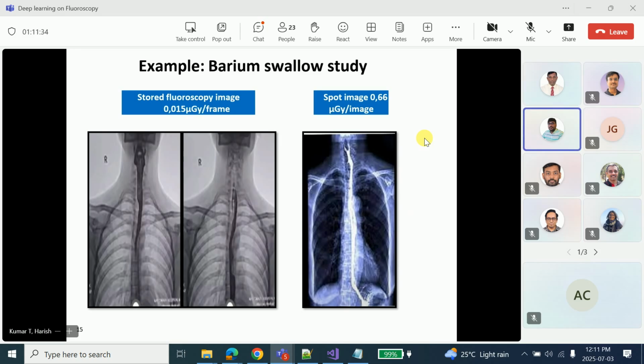So I was thinking it would be only part by part. If I don't capture it in fluoroscopy, the contrast will flow away. For example, can you see any contrast in this image? There's no contrast. If you don't capture it in fluoroscopy, in a radiograph you only see this. Here, the entire capture is there. You can see the entire contrast, and the entire food pipe, your esophagus, is completely seen. Here, somewhere it is narrowing off.